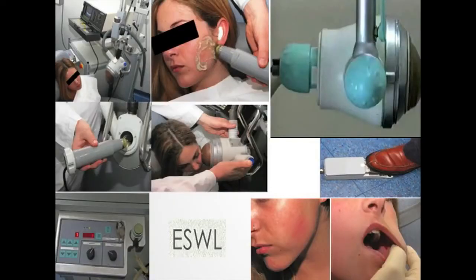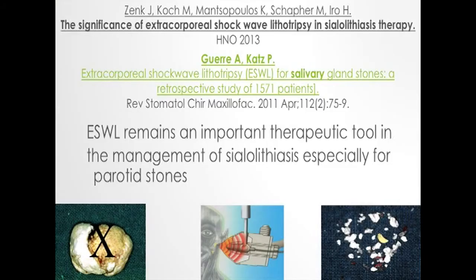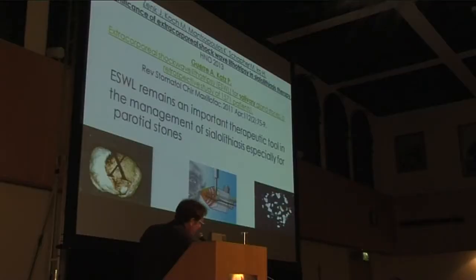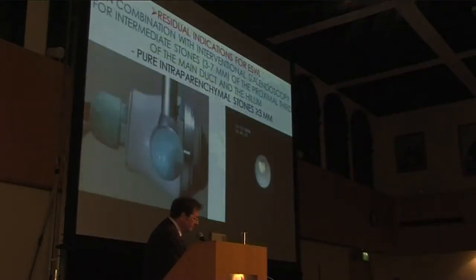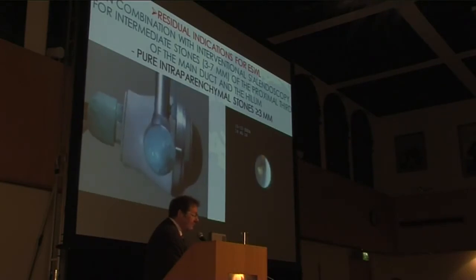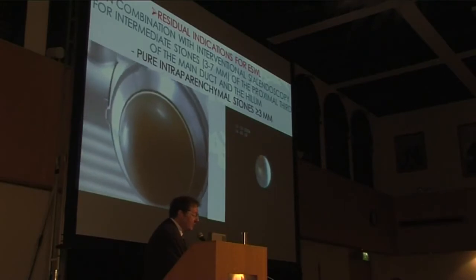Here is extracorporeal shockwave lithotripsy — I started with this technique 20 years ago. In my experience and that of German and French colleagues, extracorporeal lithotripsy remains an important therapeutic tool in the management of sialolithiasis, especially for parotid stones. But we demonstrated some years ago that extracorporeal shockwave lithotripsy is not effective for more than 30% of submandibular stones, particularly those located in the hiloparenchymal region that are more than 7 mm.